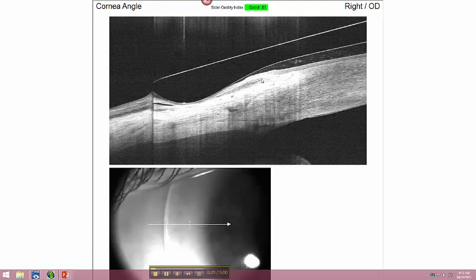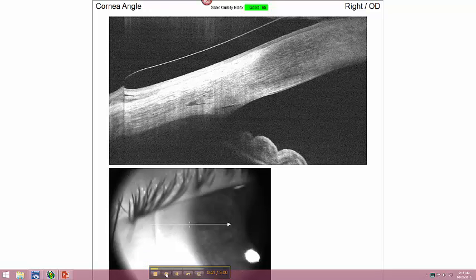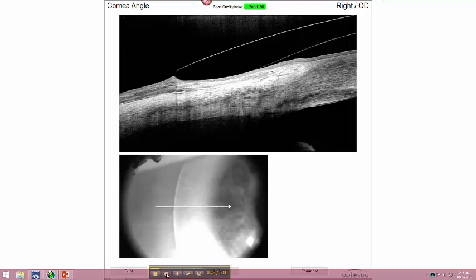This is not a design that I would have wanted, but I had created in Wave previous to this new design. Ski jump profile here and kicking up a lot of debris. This lens was also designed using Wave, not ideal either, touching the cornea, limbus, and conjunctiva. So how to create a profile that looks like this, parallel and with limbal clearance?